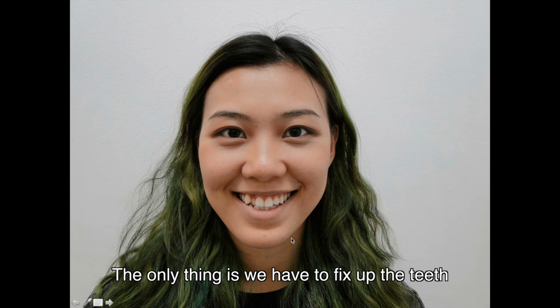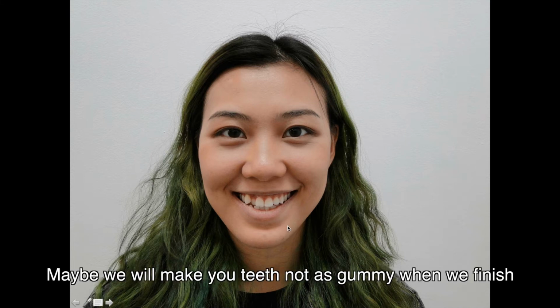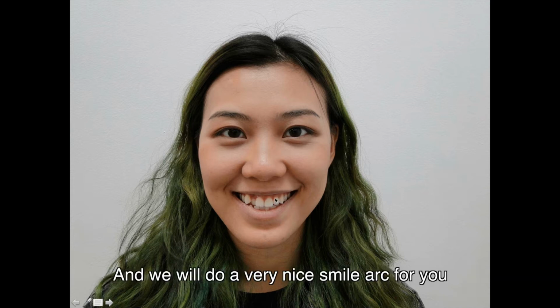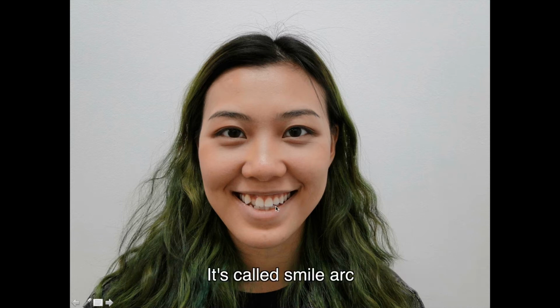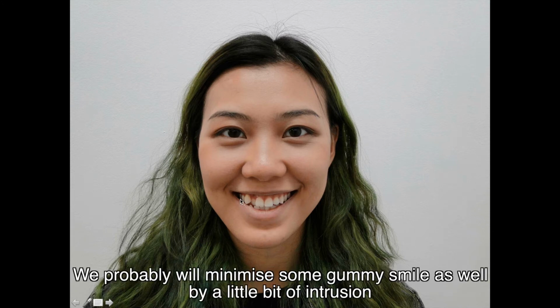Okay, next. Now this is how good you are. The only thing is we have to fix up the teeth. Maybe we make your teeth not as gummy when we finish. And we will do a very nice smile arch for you, which will be mirrored to your lower lip. This is called smile arc. We will produce a very nice smile arc. We probably will minimize some gummy smile as well by a little bit of intrusion.